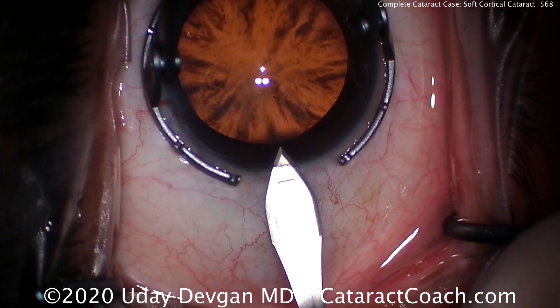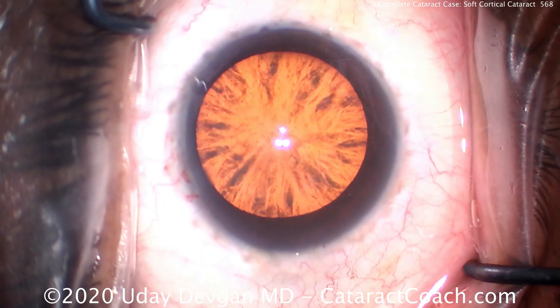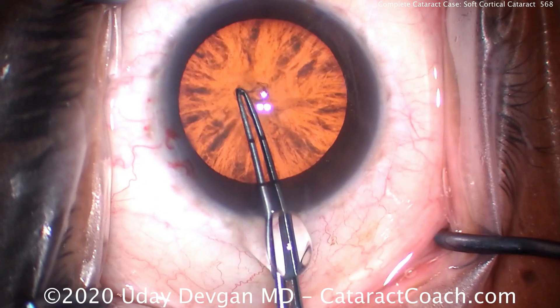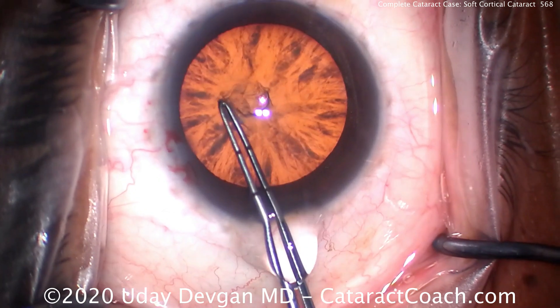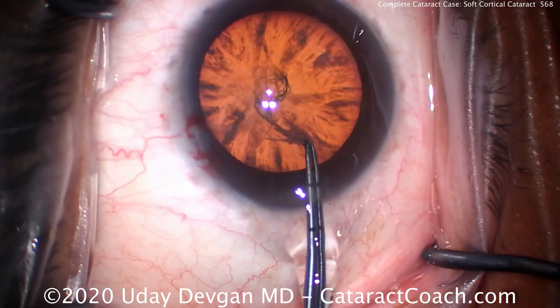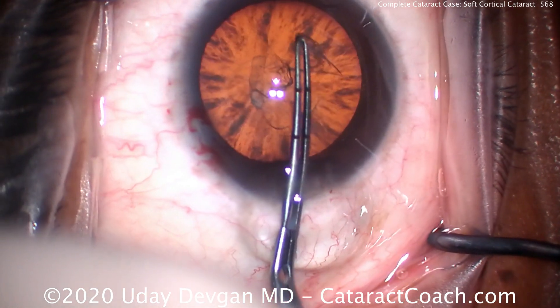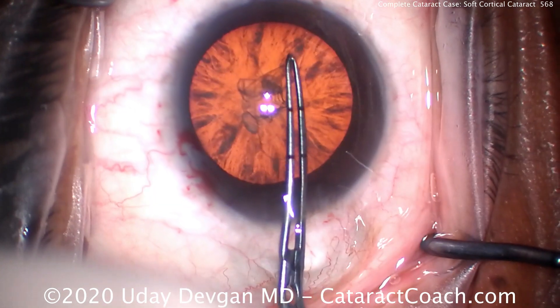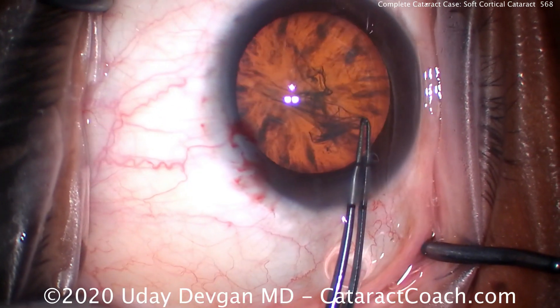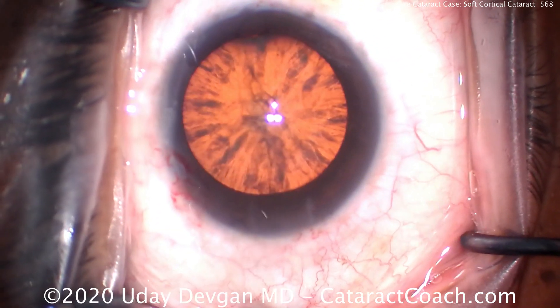We're going to do cataract surgery, which is going to restore a tremendous amount of vision to him. Now for the capsulorhexis, it may be tougher to perform because the view isn't as good. One trick: don't let go of the capsulorhexis directly over an opacity — let go to re-grab only where you can still see it. Try to minimize the total number of grabs. You can also use trypan blue dye to stain it.